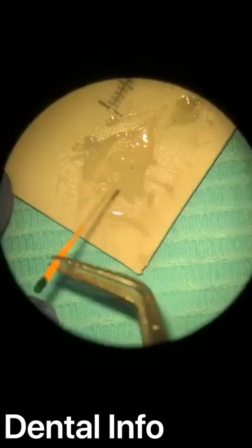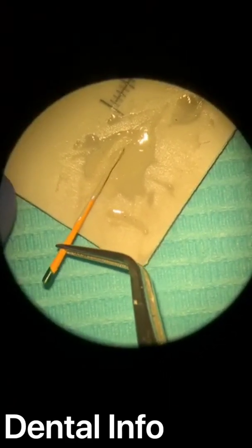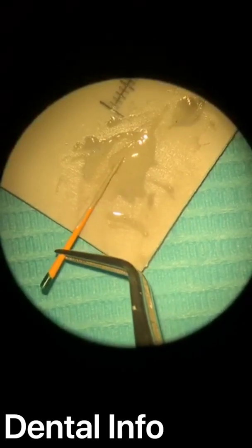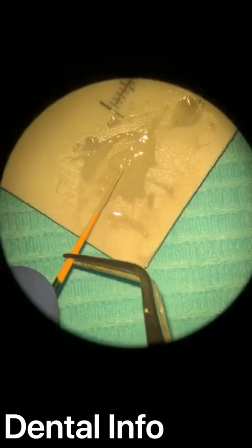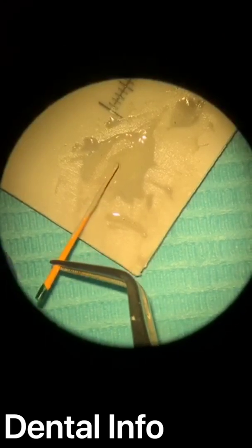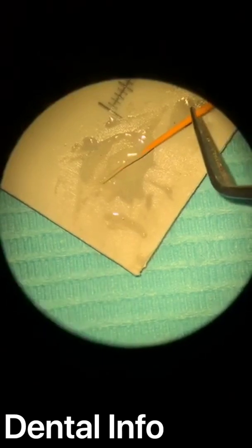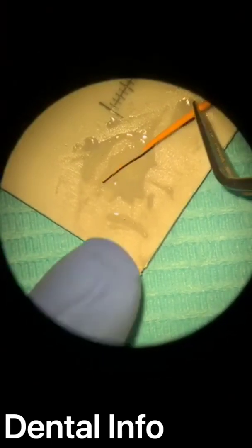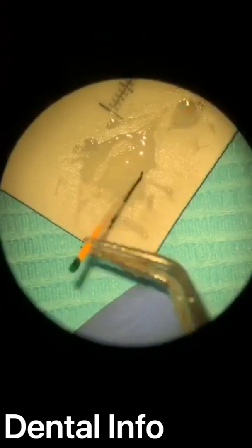we have to have a minimal quantity of sealer, because as I told you, this is not bioceramic sealer. This sealer may shrink. This sealer may be resorbed somehow. So you have to put the minimum quantity just to close the space between the cone and the walls as much as you can.